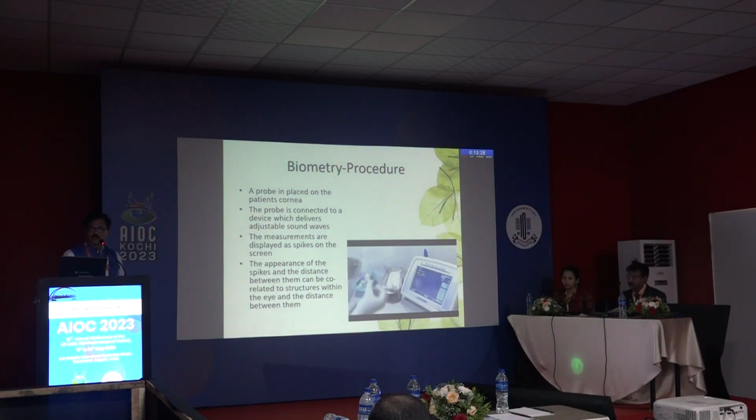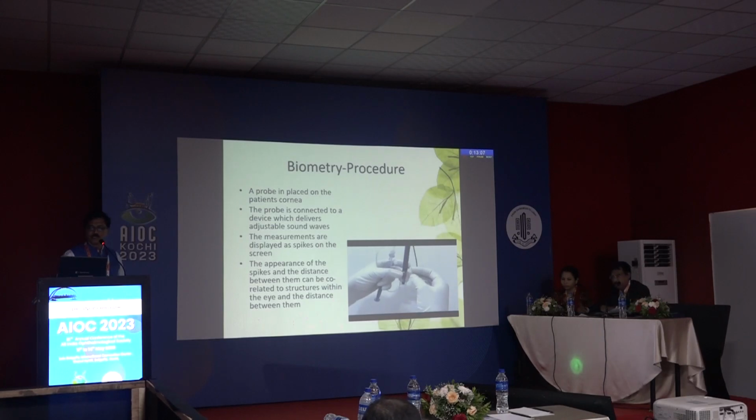Here I am demonstrating the immersion one. So you have to sterilize the Prager shell. It's always better to use 100 ml normal saline, which can be disposed at the end of the day. You have to fix the probe into the Prager shell so that its lower tip comes up to the line, as you can see there, and then lightly screw it. You should not screw it very hard, you may damage the probe.